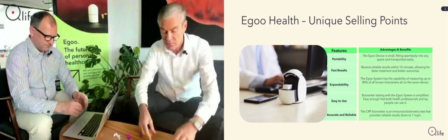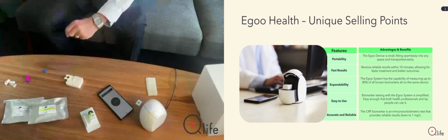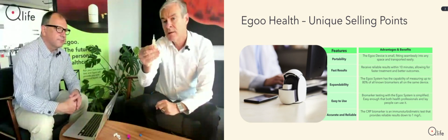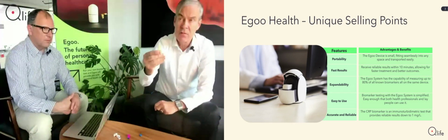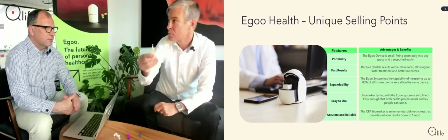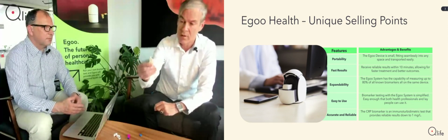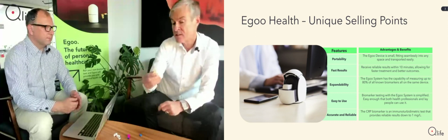Yes. So now you can pull it out. And you can see, if you look up here, this little 5 microliter capillary is filled with plasma. And that's basically what it is. And the reason for measuring in plasma is that most biomarkers should preferably be measured in plasma, because we want to have the same clinical grade quality as in the laboratory, right? Of course. Other systems are measuring in full blood, and that's simply not as good.